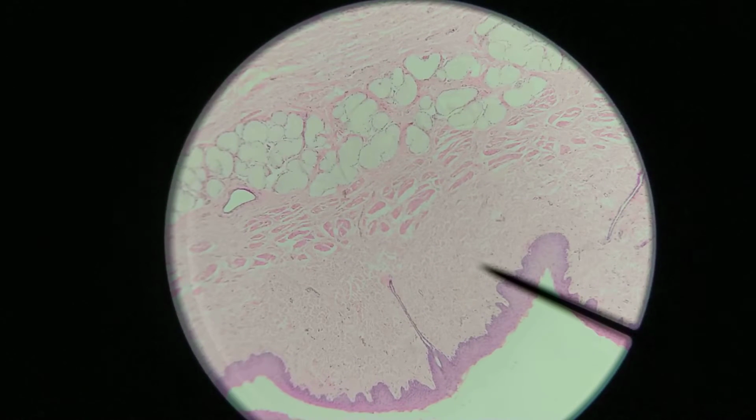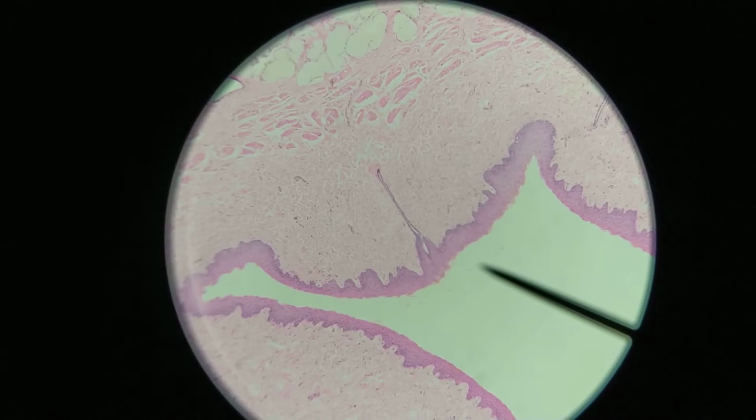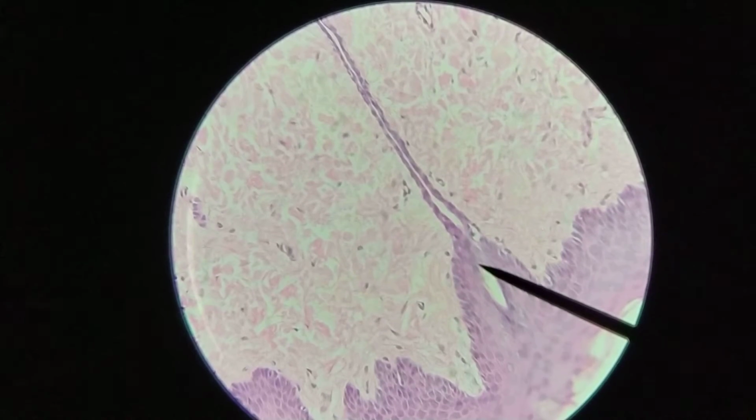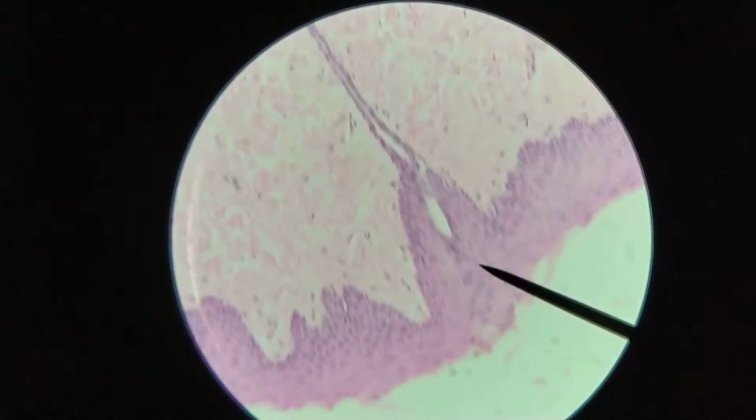Okay, so let's take a look at this in a little bit more detail now, at a higher magnification. Let's start with the epithelium. This is 100x, and we're going to move to 400x magnification. Again, what you're seeing here is the duct leading from one of the submucosal glands up to the surface.